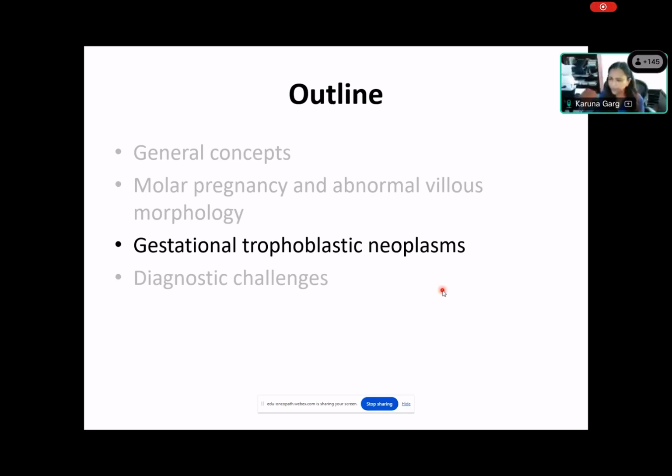Then please explain the morphology of fibrotic villus. Fibrotic villi will be small villi where, normally, when you see the villus stromal cells, they are spread out, they are hypocellular, they're small cells, there's a lot of empty space. With fibrotic villi, that will be obliterated and there will be fibrosis within the villi. Basically, that's the gist of it.